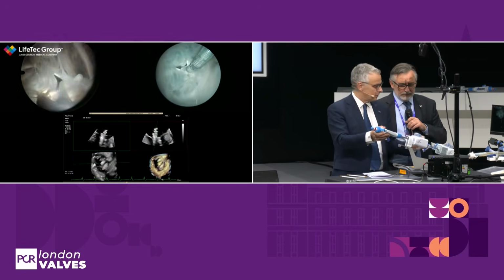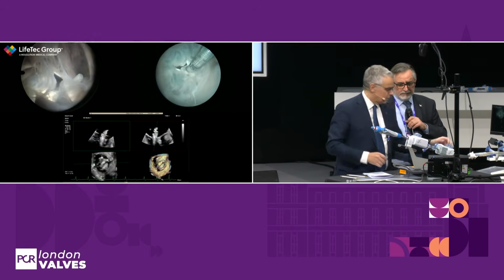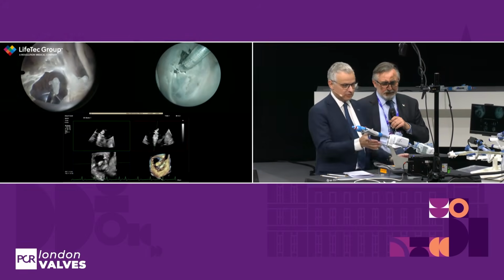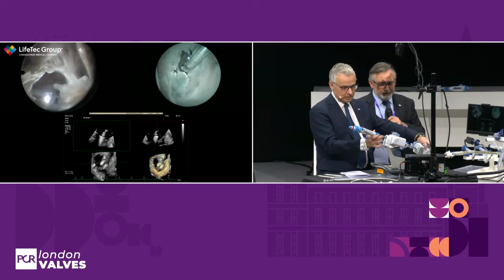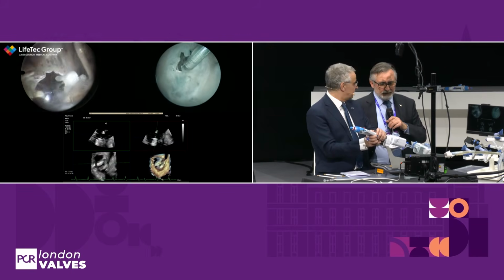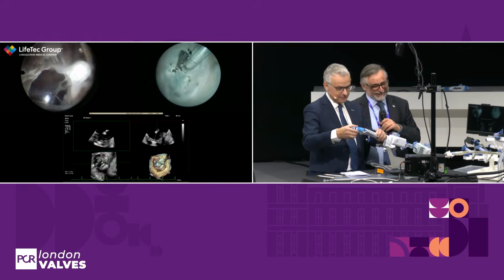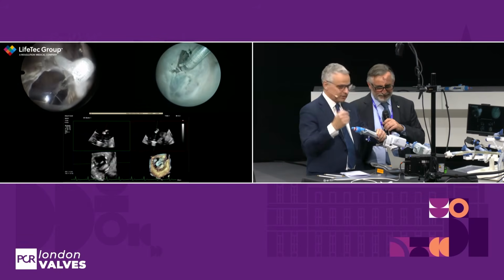And maybe we should be more lateral. A bit more lateral, no? Yes. So we go a bit more lateral. We have the head knob, which will bring us also a little bit more posterior. You agree? Yes. And now we are pretty nice. Let's go in. You agree? Yes. Thank you. We open. Grippers are up. We didn't check grippers, but it's okay.